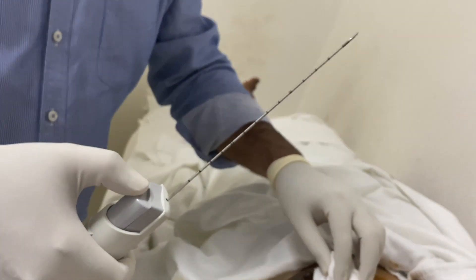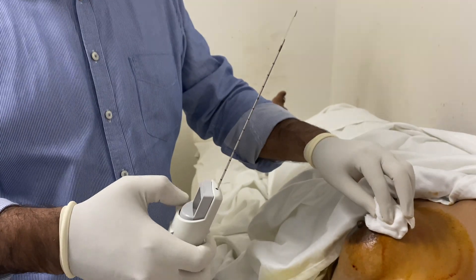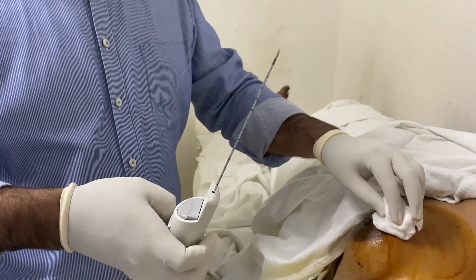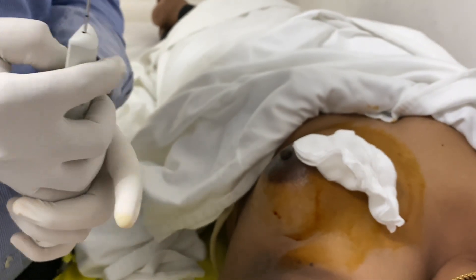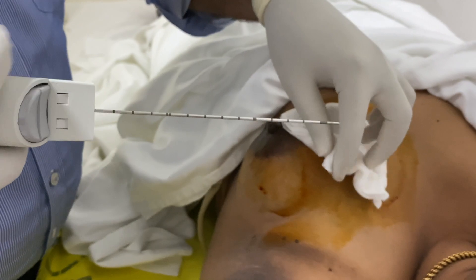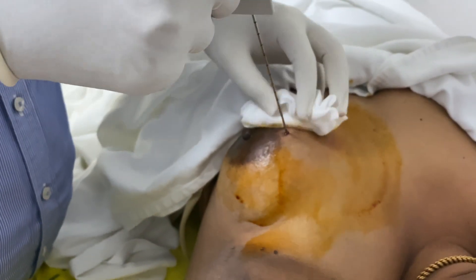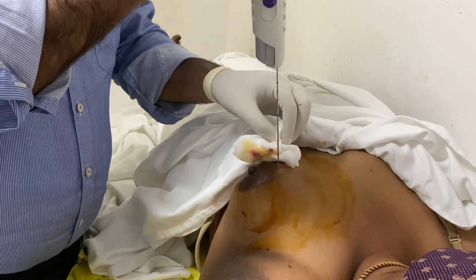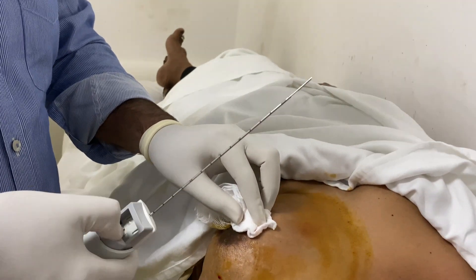Charge the gun, fire, and recheck that the gun is working, then charge it again. Insert it inside the skin at the surface of the lump. Once you fire the gun, take it out.